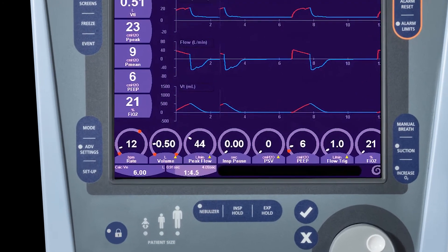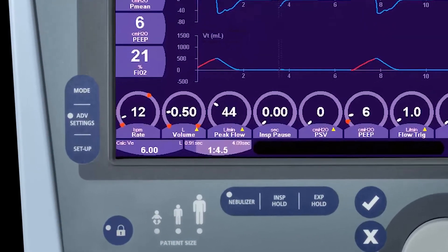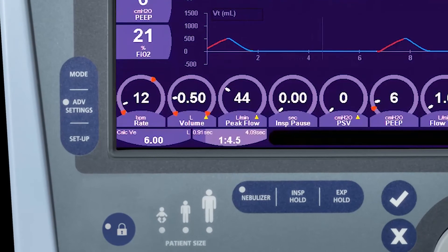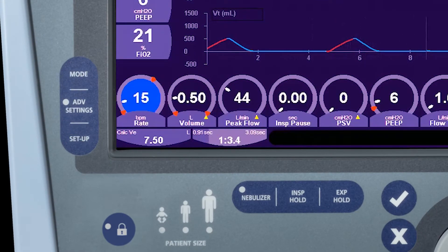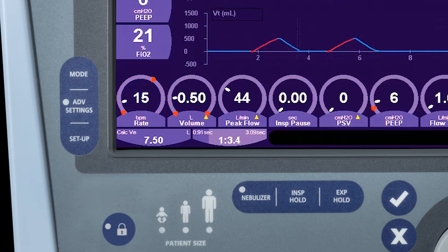To change a control setting, select a control — in this case respiratory rate — adjust it to the desired level, and either touch the control again or push the accept key on the front of the ventilator. All controls are changed with this standard touch-turn-touch three-step approach.